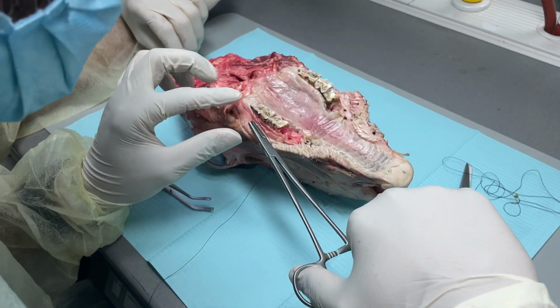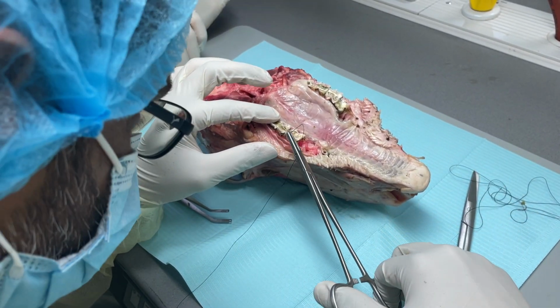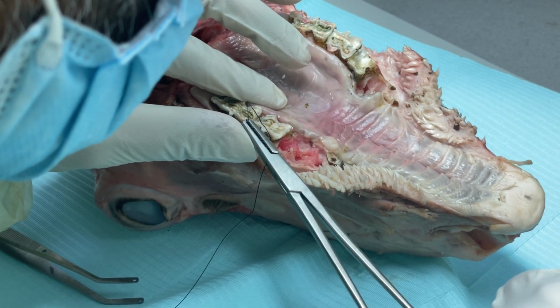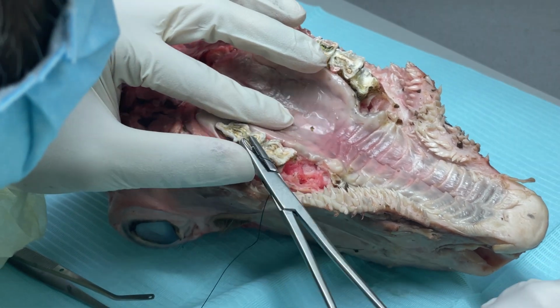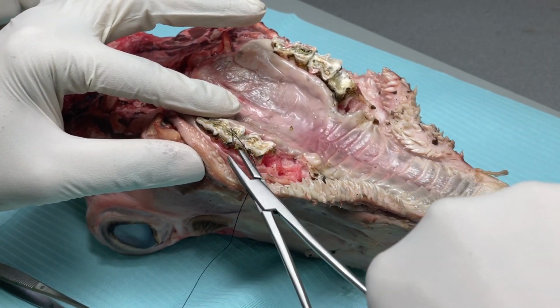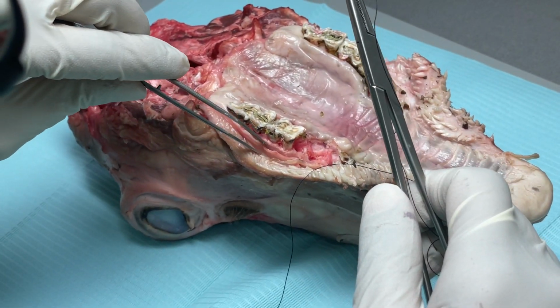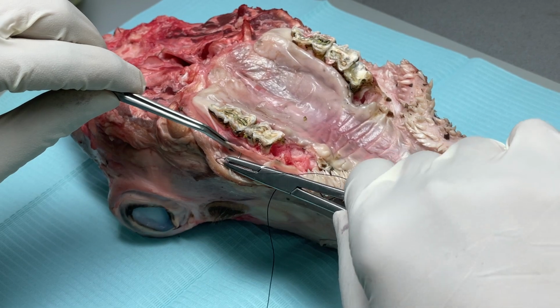Let me first see if it passes interdentally. The contact is too tight, but I can get it. No, it's coming, no problem. It's just a broader contact, because they chew and it gets attrited. So, from here, I have taken the bite.